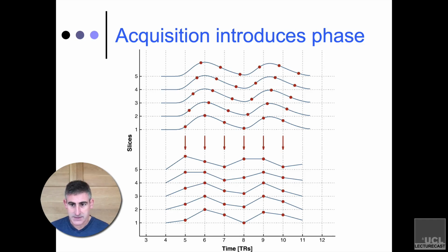And the important thing to see here is that in one case, you're getting a good sampling. In one case, you're getting an awful sampling. And that's still within a single volume, a single TR, right? Even though the underlying response that we're trying to measure is exactly the same, they don't look the same in the measure that we've taken. And that's because of this sampling of the hemodynamic response function and the fact that it plays out over time rather than being an instantaneous measure.